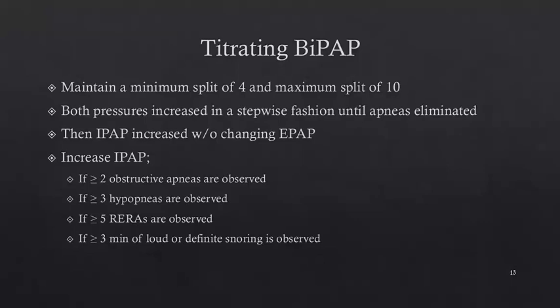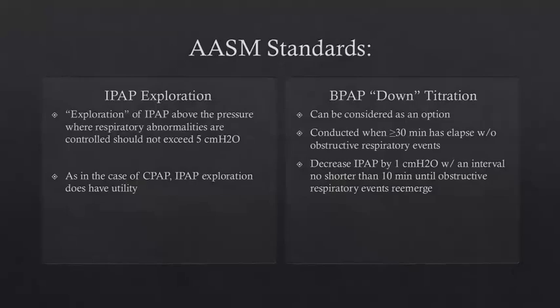Optimal IPAP really is achieved once all the arousals, hypopneas, and desaturations have been eliminated. Optimal EPAP is achieved when the apneas have been eliminated. We can still do IPAP exploration just like with CPAP.